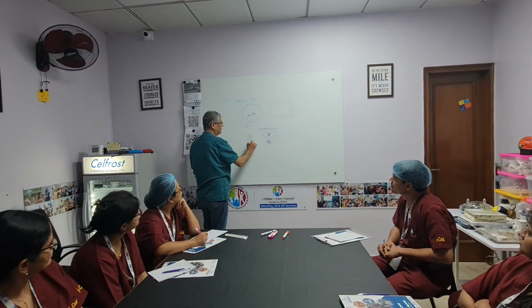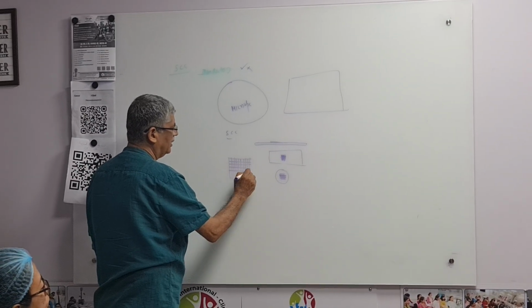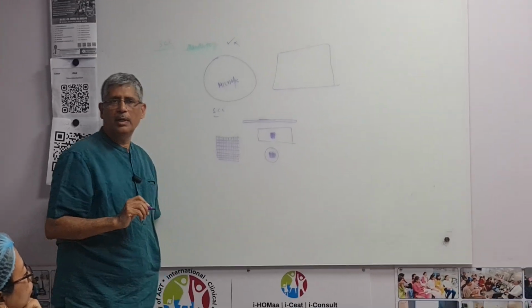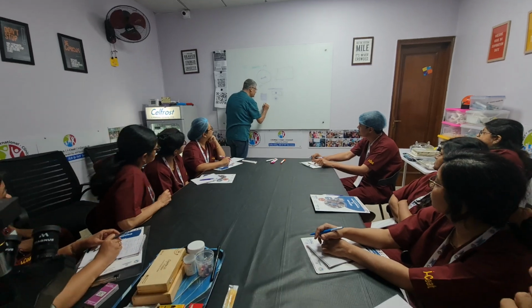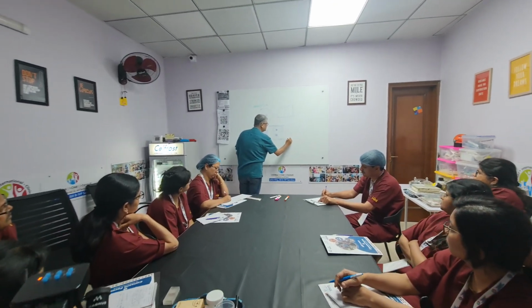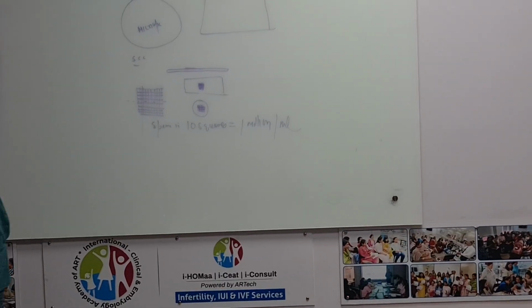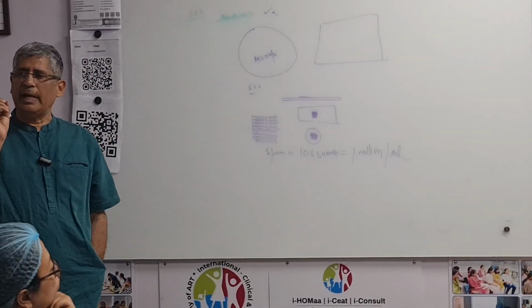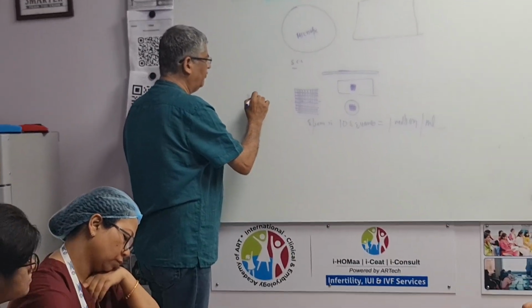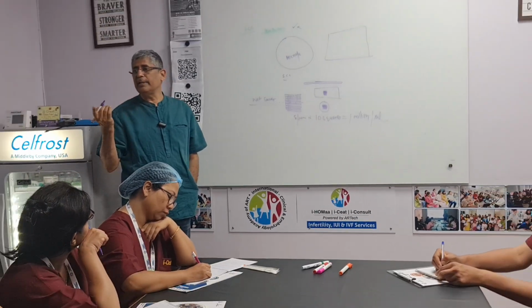So it works like this: 1, 2, 3, 4, 5, 6, 7, 8, 9, 10. There are 100 squares here. We count in any one line, like this, or like this. The number of sperms in 10 squares is the count in million per ml. It's a concentration. So it's a very easy method whenever we are counting sperms, but this is only for semen analysis on the wet smear. On the wet smear, you can't do anything more than this. When you are counting and looking at the motility, that's all you can do with this.